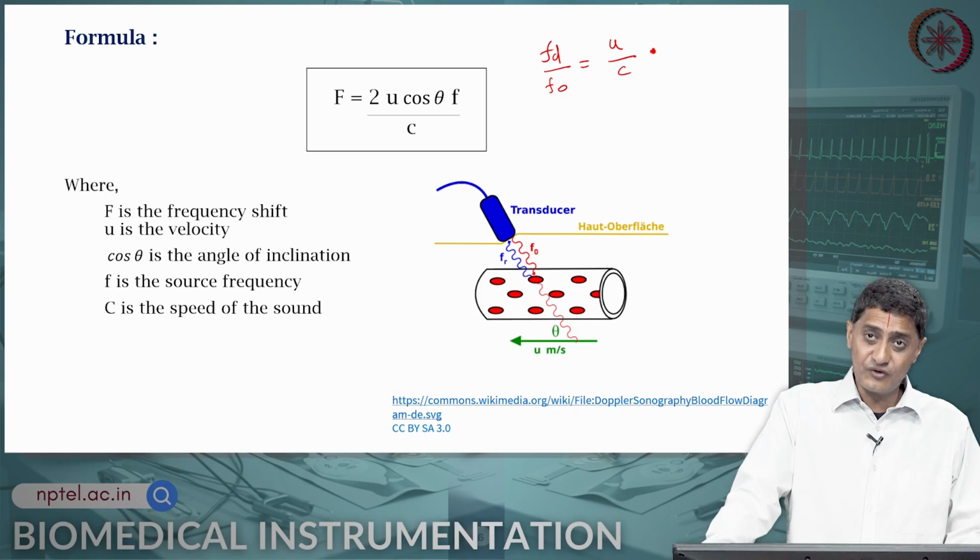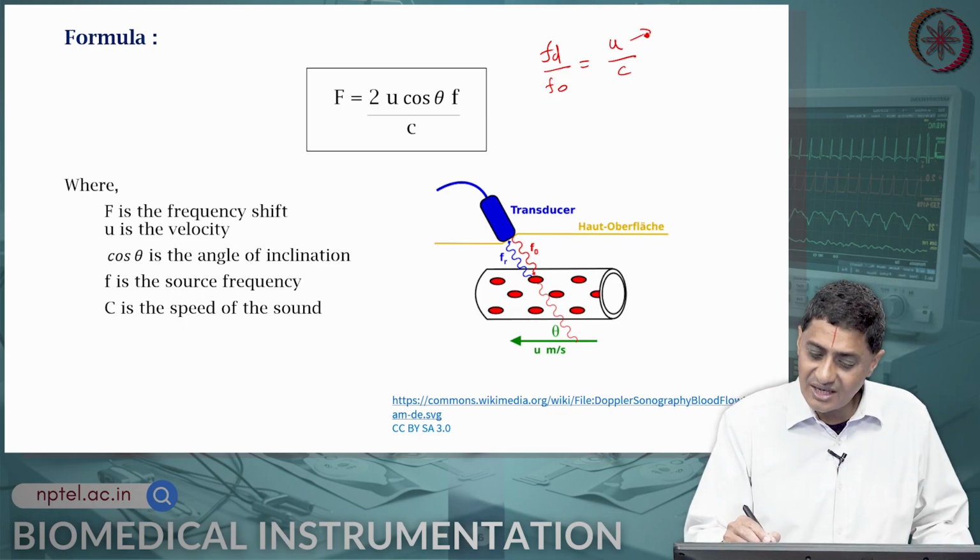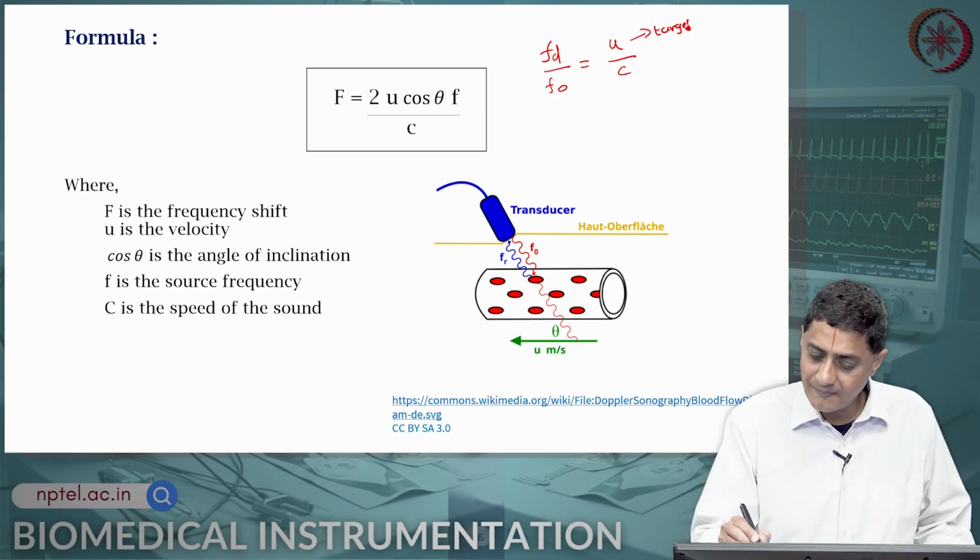One is the velocity of the flow, the other is the velocity of sound itself. This is the target velocity of interest for me.